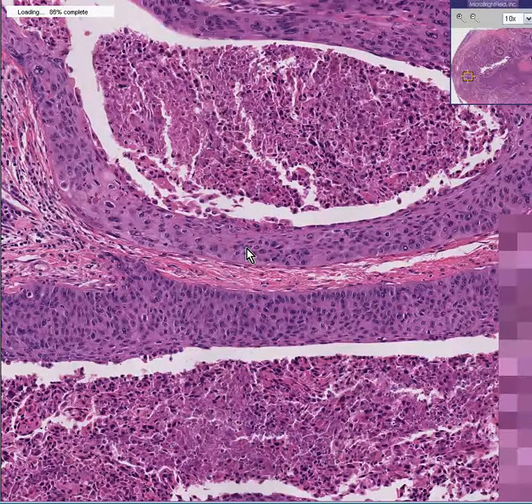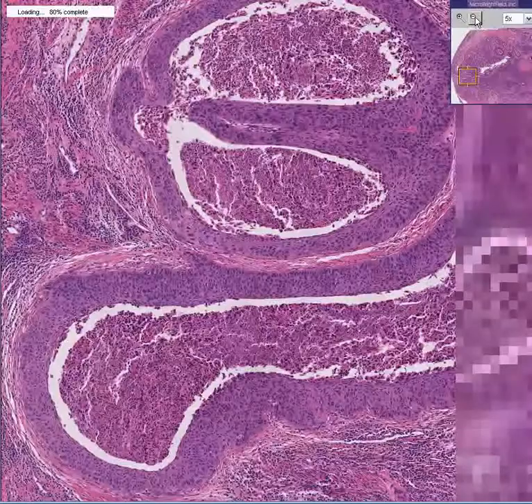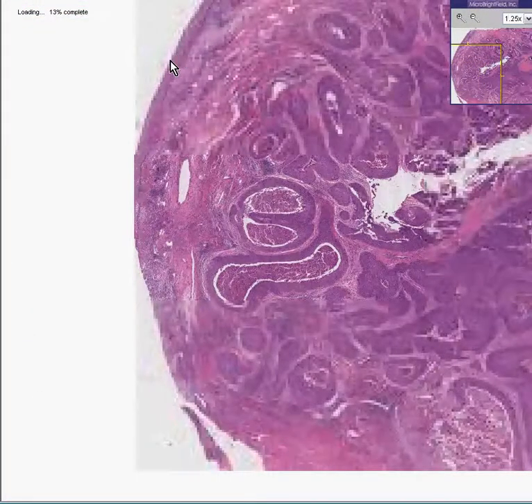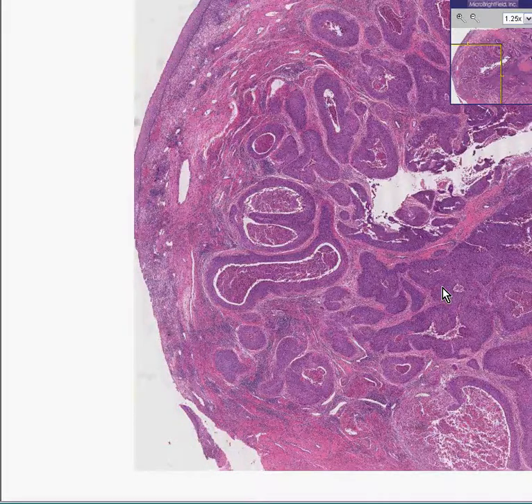But in this case, not only do we see an obvious cancer, but we see all these coilocytotic figures with the clear zone around the nucleus. So to make a long story short, this is a pretty extensive squamous cell carcinoma underlying the squamous epithelium part of the cervix, in which there are a lot of HPV changes as well. There's no doubt as to what caused this cancer, and I thank you very much.